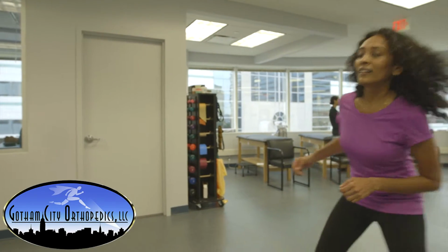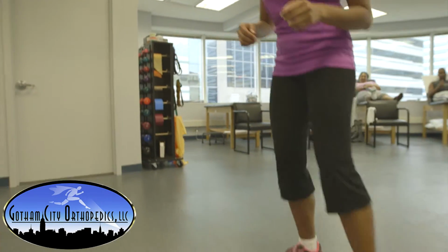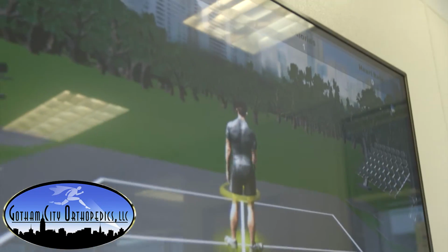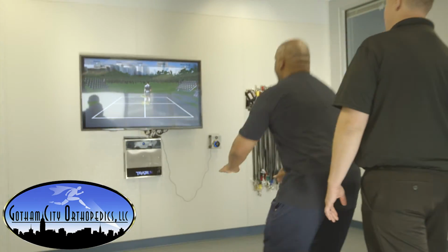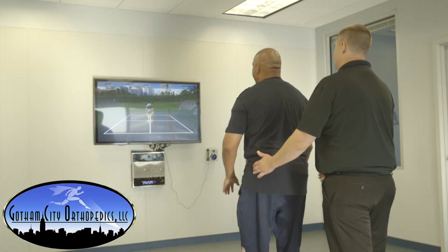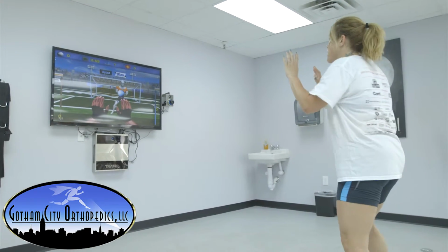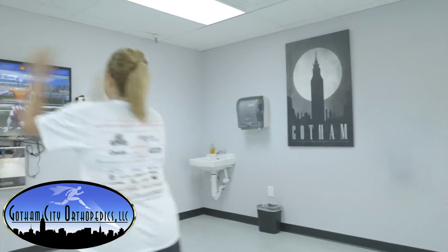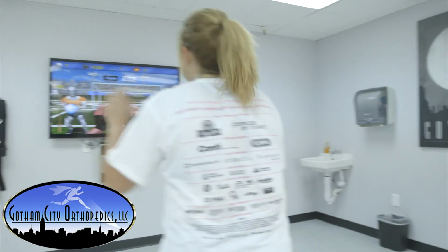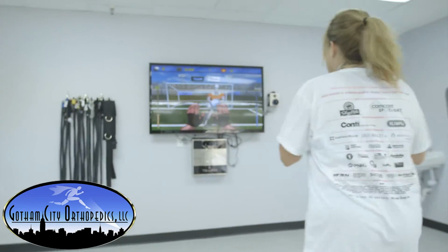What we're most concerned about after a patient has a concussion is when are they ready to return to sport. So once someone sustains a concussion, their symptoms return to normal, we then present them with their final Trazer test, and if they're really ready to return to play, then we'll have a score that's very similar to what their baseline was. And if they're not ready, I assure you, I took the test myself, if you don't have all your faculties, you're not going to make it. And so this allows us to simulate a game situation without putting these kids at risk.